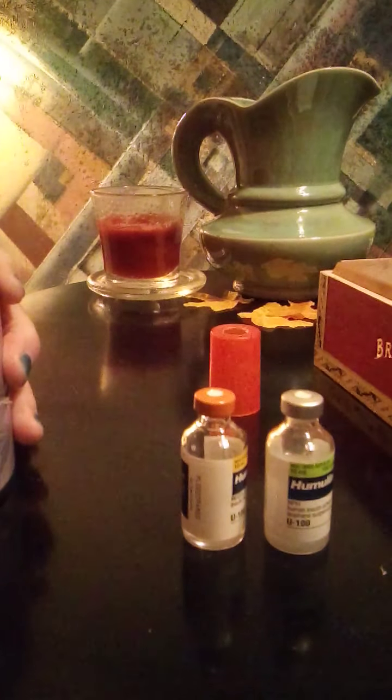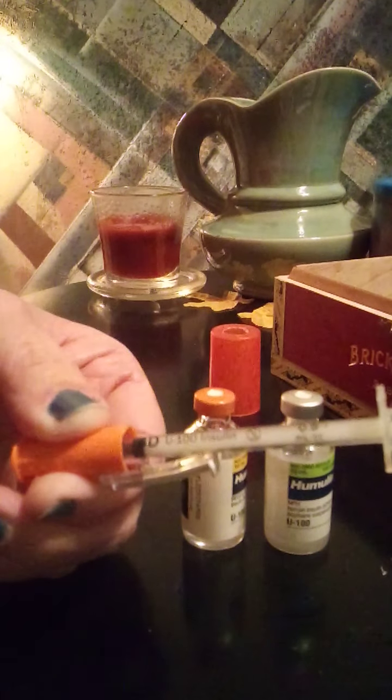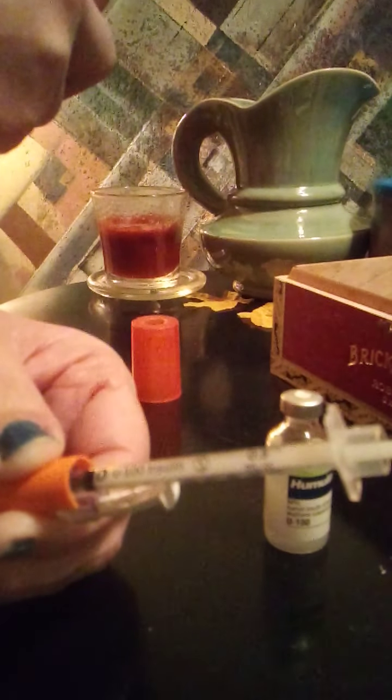And it's the RU500, and they're going to give that to me because it's a little more dangerous if you make a mistake with it, because you've got more intense impact. Let me see if it says on this one. Yeah, it says BD, which is a name brand, U100 insulin. So this syringe is made for U100. So when I go over to the U500, I have to be very, very careful, and I'll have to have different types of syringes.